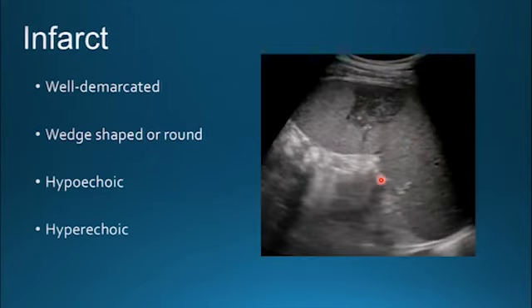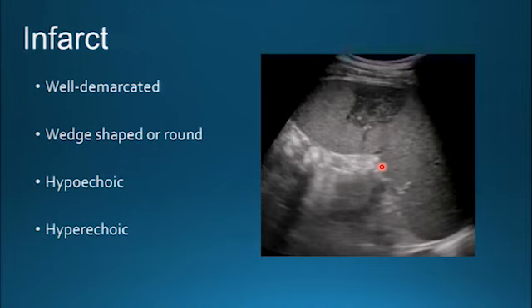Infarcts of the spleen are generally well-demarcated with a wedge shape or may be round in nature. They can be hypoechoic and can be caused by leukemia, lymphoma, or other infiltrative processes.